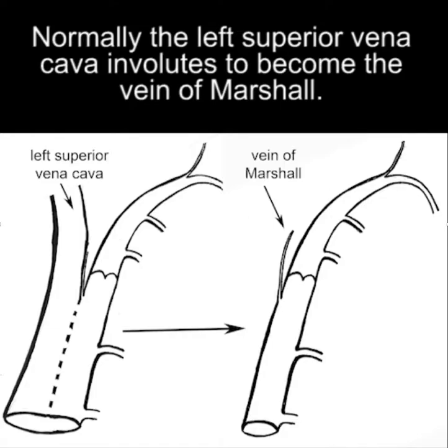This video is a step-by-step process of implanting LV leads in patients with a persistent left SVC.